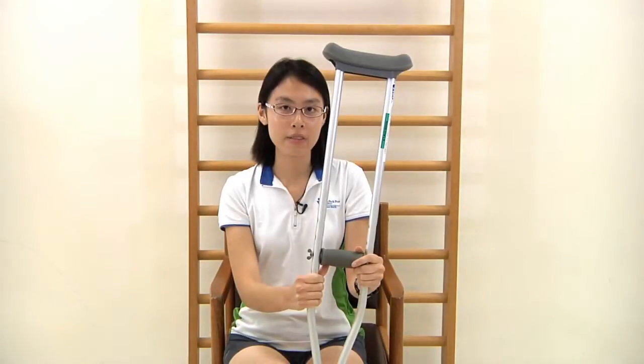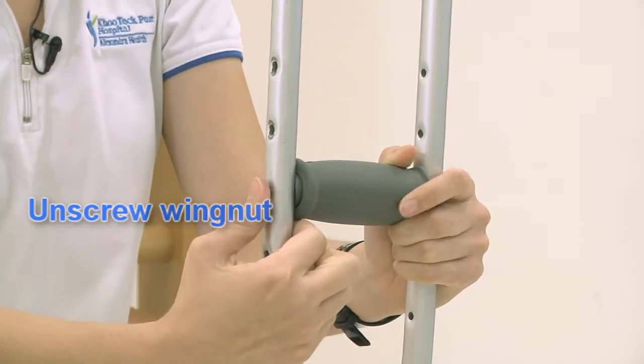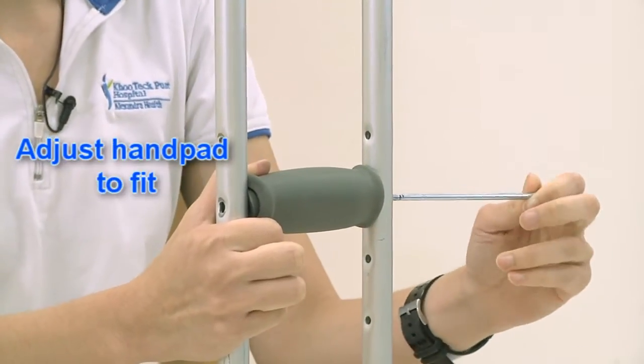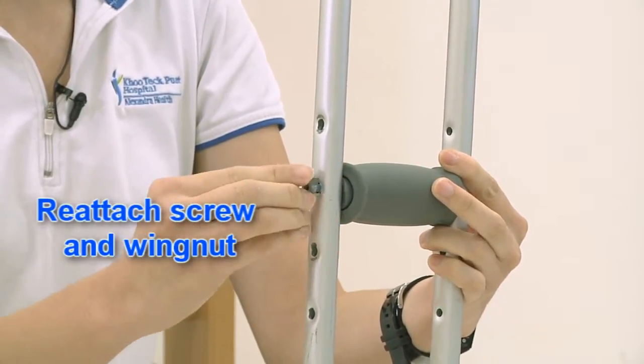To adjust the height of the hand pad, unscrew the wing nut. Remove the screw and adjust the height of the hand pad accordingly. Then reattach the screw and the wing nut.